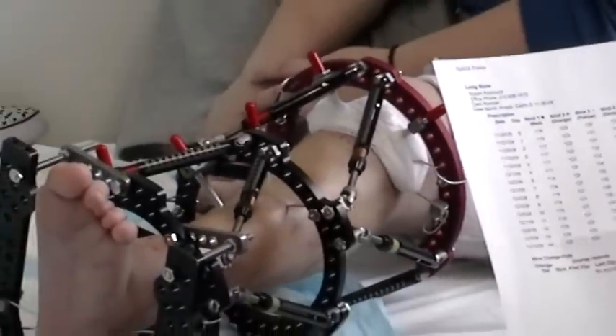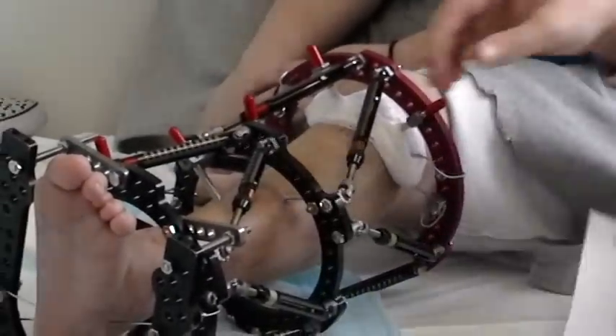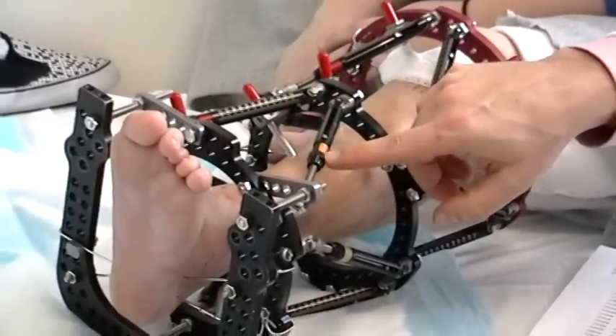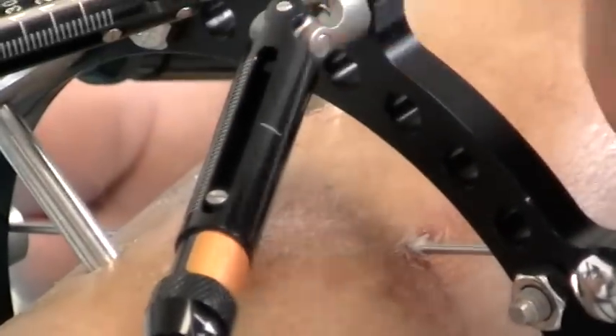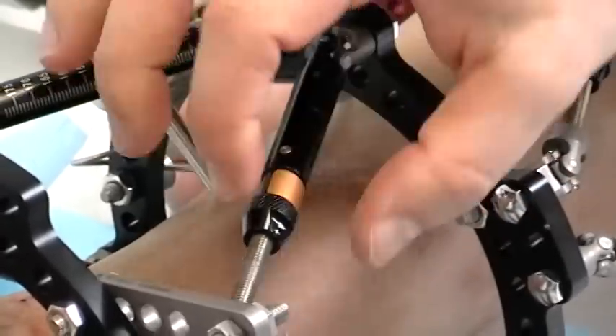If the strut ends up increasing in size, you would go in the direction of the arrow. If you want to make the size of the strut smaller — meaning if the strut is supposed to go to a smaller number — then you would go in the opposite direction of the arrow.